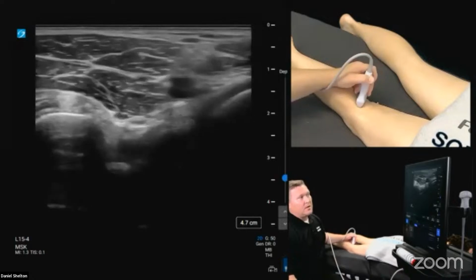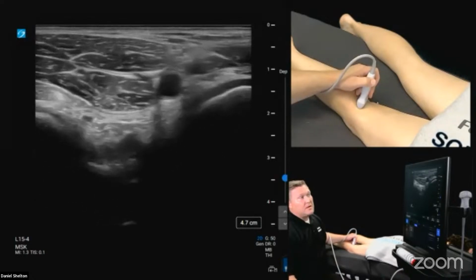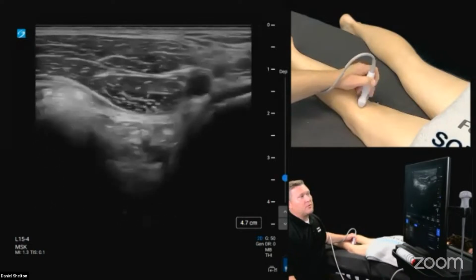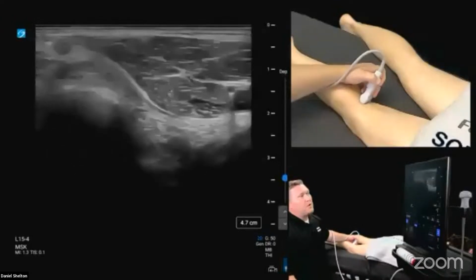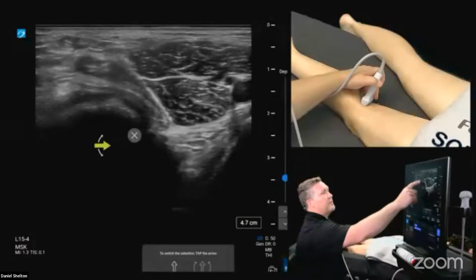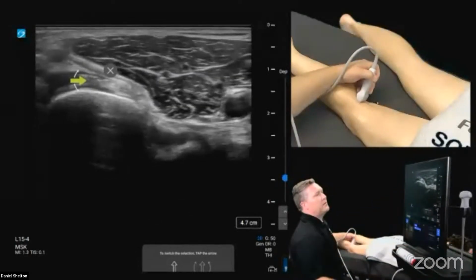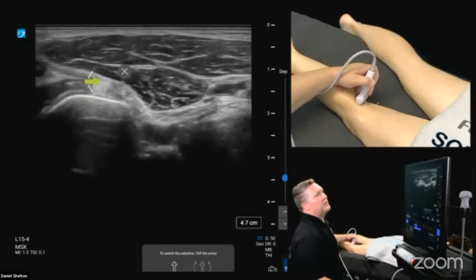So it's kind of helpful in not having hyperextension of the knee, but basically it's a very broad ligament that jumps over the rest of the articular capsule. It does climb under the semimembranosus. So if you can find semimembranosus, I thought this was a really cool, easy way to scan it. Find semimembranosus, remember that shadow that dives to the tibia? So here we go, here's the tibia right there. There's a second little layer underneath it, and that's what this posterior oblique ligament is.